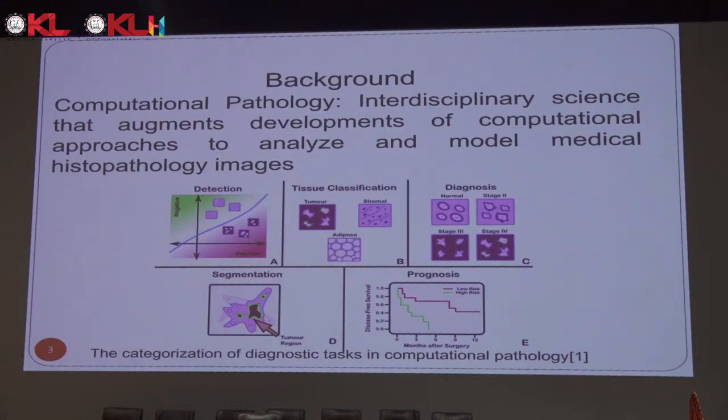Histopathology, as we know, is having biopsy slides and watching under a microscope. Now, if that can be digitized, it brings a lot of data for analysis, and we can also do multimodal development.